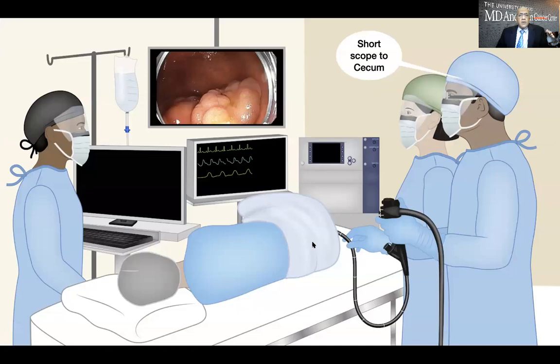The most important thing for therapy is your ability to reach the cecum with a relatively short scope without loops. You could easily reach the cecum between 60 to 70 centimeters, even in somebody who is about 5'10" height, or even 6 feet, about 70 to 80 centimeters for a little bit taller people.